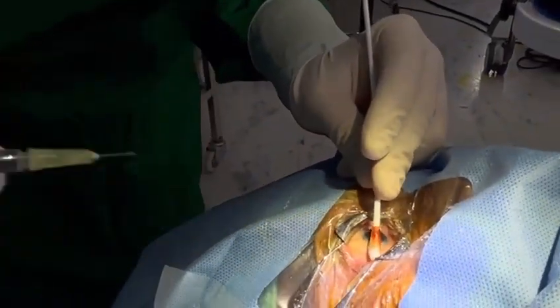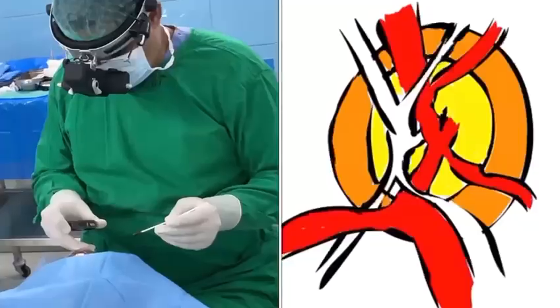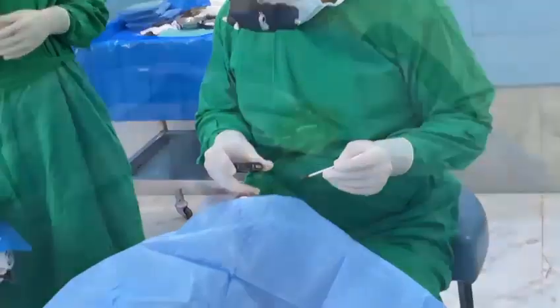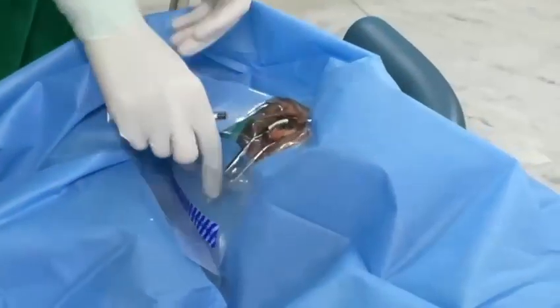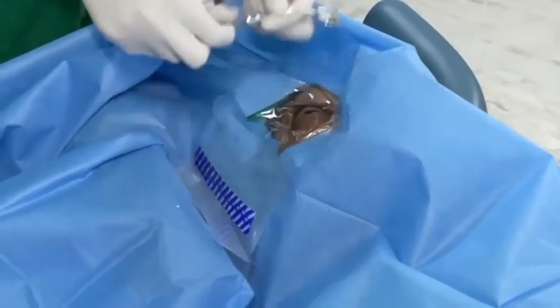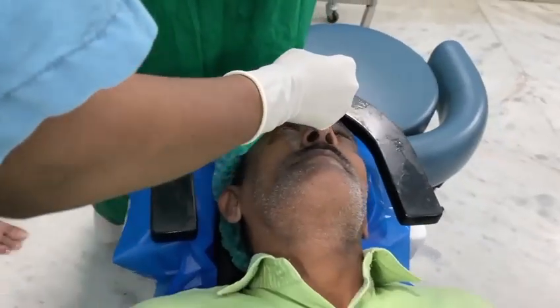Post-injection indirect ophthalmoscopy is done by the doctor to check for disc perfusion. Speculum and drape is removed and the eye is patched.